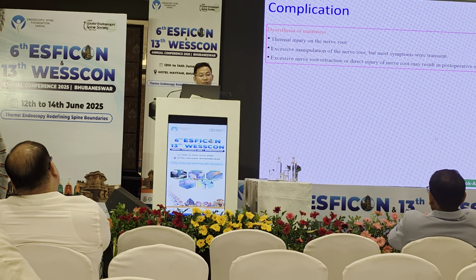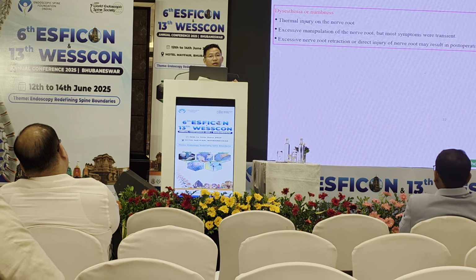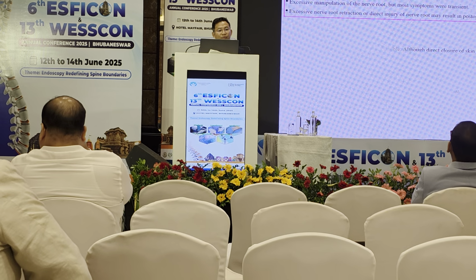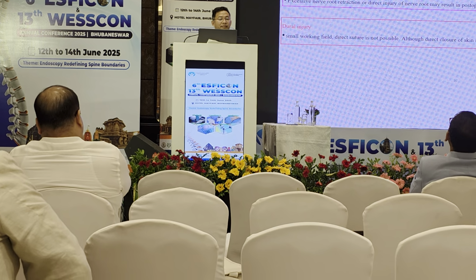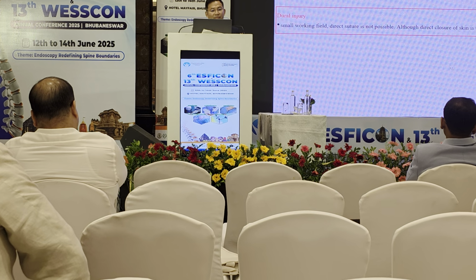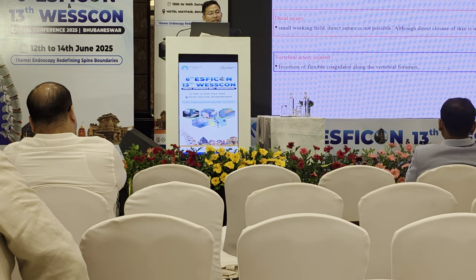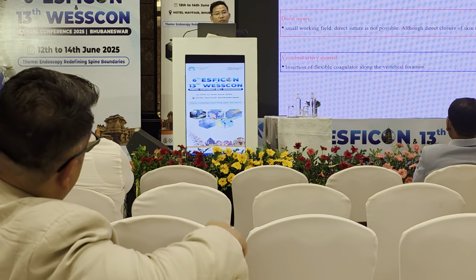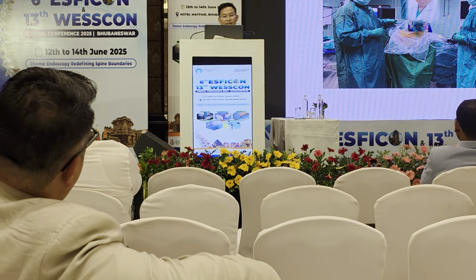And we already know the endoscope has better results and benefits, but you have to be concerned about complications like durotomy. But the serious one is vertebral artery injury from the tip of your RF.